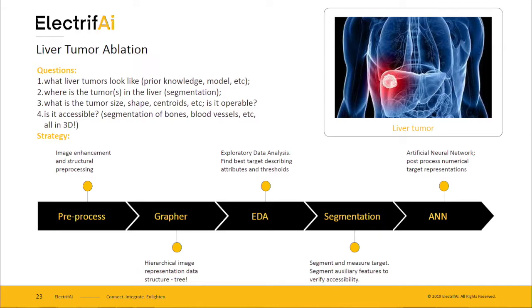This is an important question because sometimes it might be in locations that require advanced pre-operation planning, because you need to take into account arteries, you need to take into account bones or other organs that might stand in the way.